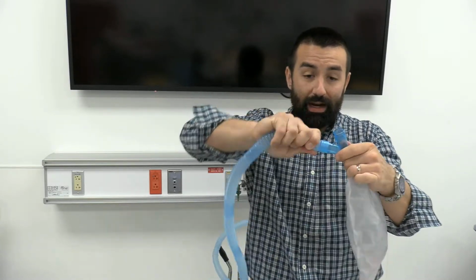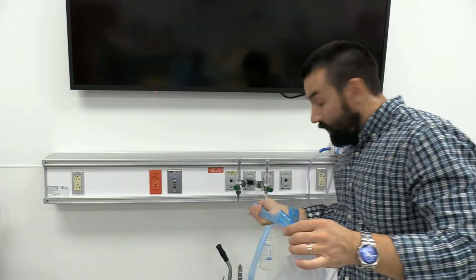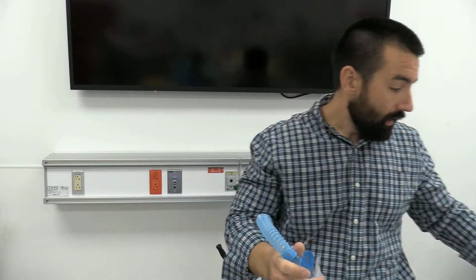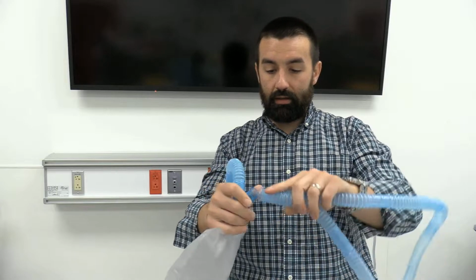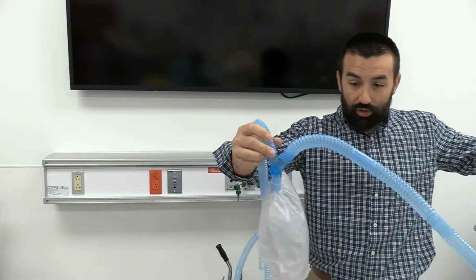Same deal. So I got a 22 millimeter internal diameter. All these things it's meant to hook to are 22 outer, so it slides on nice and easy. Then I'm going to take another piece of tubing, same length, and hook it on like this.